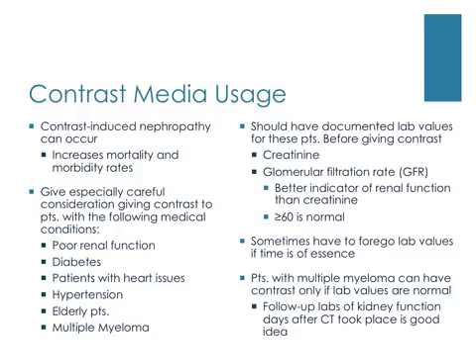However, there are exceptions to checking lab values on these types of patients prior to giving contrast, which are in trauma situations when life is in danger or of bleeding, and acute stroke or when time is of the essence. Contrast media can be used in patients with multiple myeloma, but only if the renal function is normal. And even then, a follow-up of the kidney function values should be done days after the CT took place to ensure that the kidney is functioning properly.